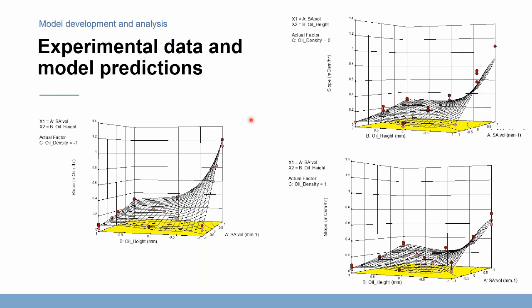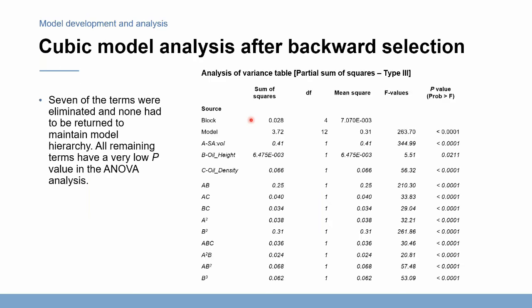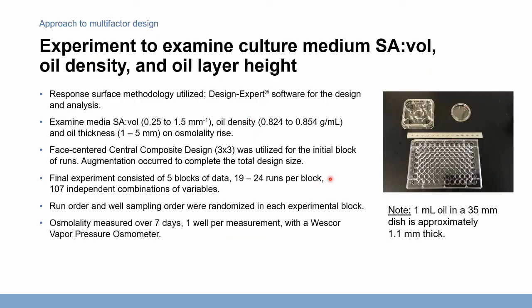In fact, in the drop setting, the surface area is a function of the volume. And when you're in a dish, and I'll see if you can still see my screen. A dish like this has real small wells, and the wells are cylinders. And so essentially you have a fixed surface area. And so the more volume you add, or the less volume you add, you change that ratio. That's the means by which I change that ratio.